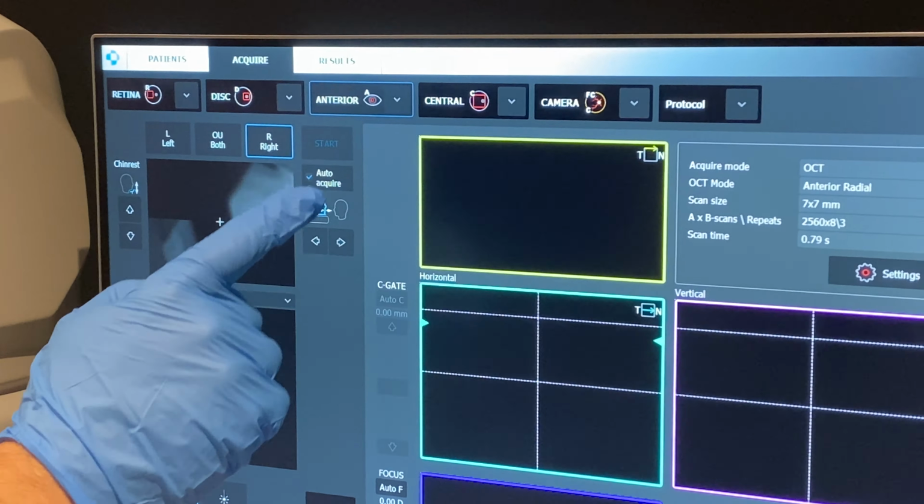And if I minimise the software, go to this output folder, under today's date, I've got a PDF of Steve Edwards, which I can drag to the desktop. And that was the screen we were just looking at. So we might want to attach that as an email to referral so the hospital know to look at that particular screen. Your practice details would be up here as well.